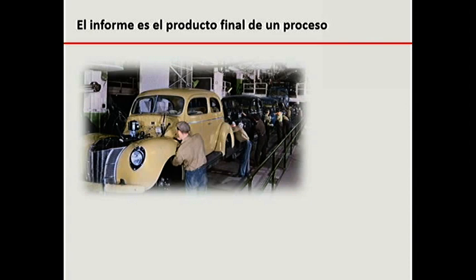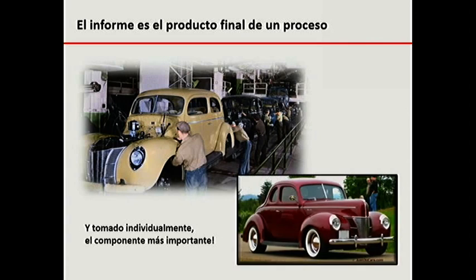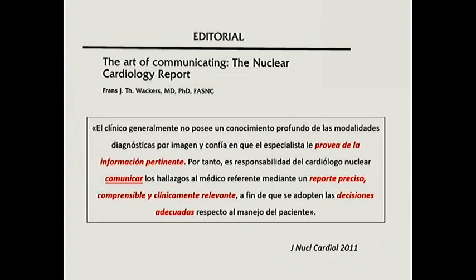Remember that the report is the final result of a very complicated process that is very expensive with the involvement of an entire team of people, which could be similar to an assembly line of a vehicle. It is the most important component taken individually. If we see all the different components of the process of nuclear cardiology, individually, we do consider that the final report is the most important thing.